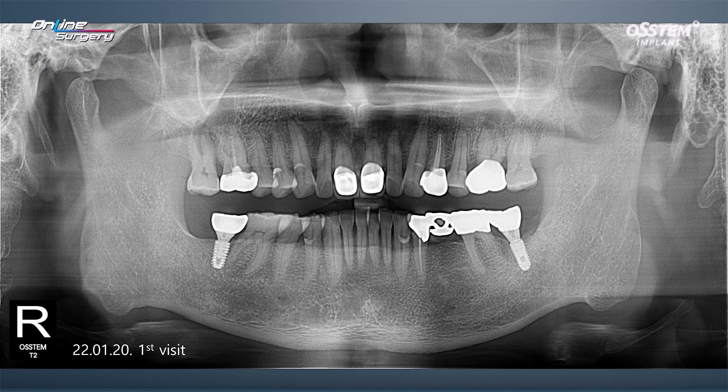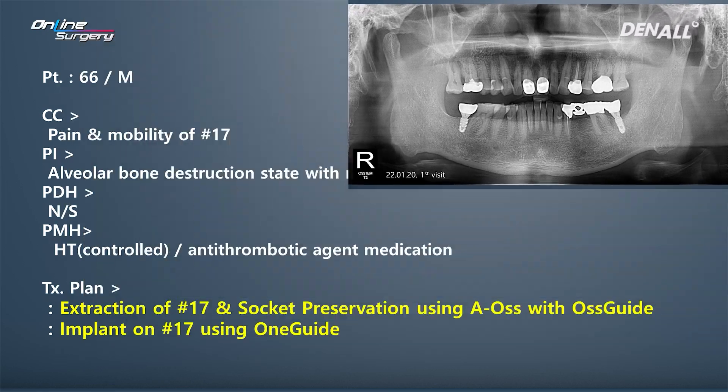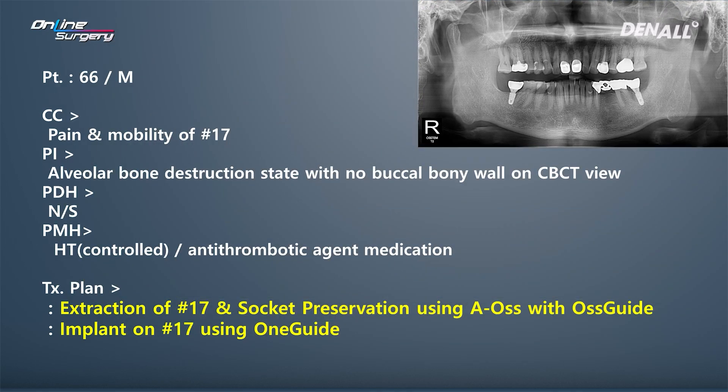This is a 66-year-old male patient. In the upper right, number 17, there was severe mobility, swelling, and pain. That was the chief complaint.